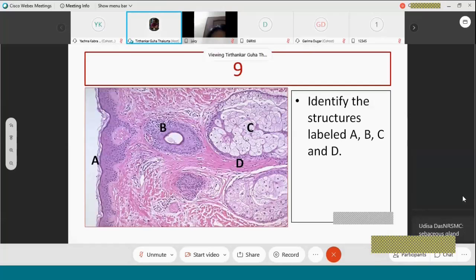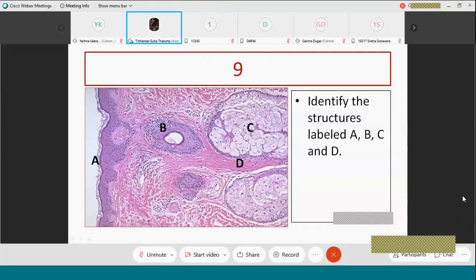Okay, I got your answers. So you are divided between glands and blood vessels, etc. Let's go one by one, step by step to understand this. It has a hollow core, so it may be something spherical or cylindrical. All around we see multiple cells lining it. Had it been a blood vessel, it should not be lined by multiple cells. Also, the hollow portion is not lined by any epithelium, so it cannot be a gland. A gland must have a lining epithelium. So what is this cylindrical thing that stains pink, is surrounded by cells and grows as a long cylinder?